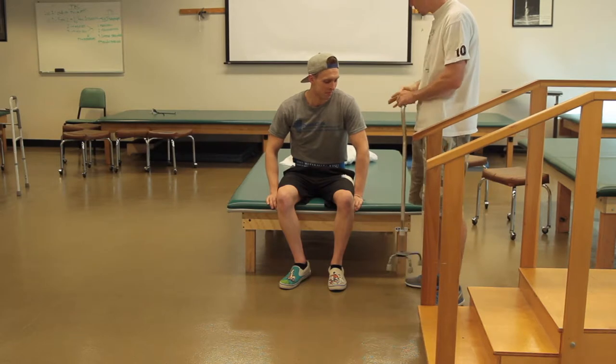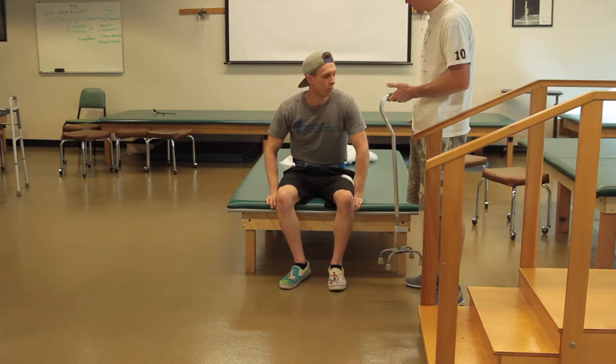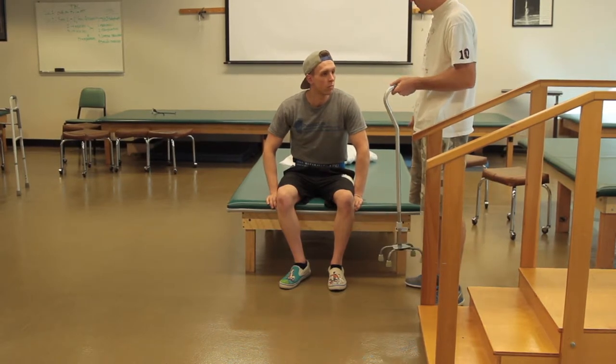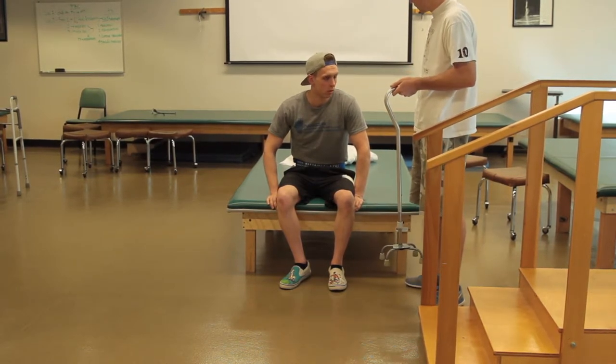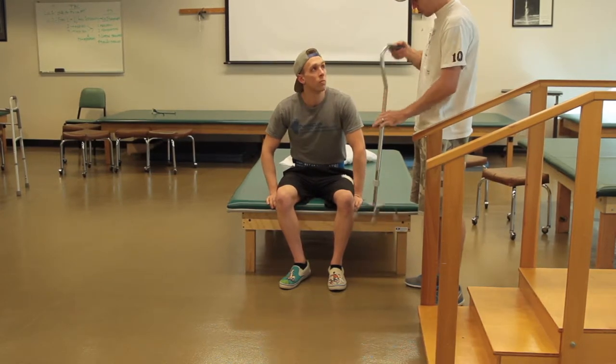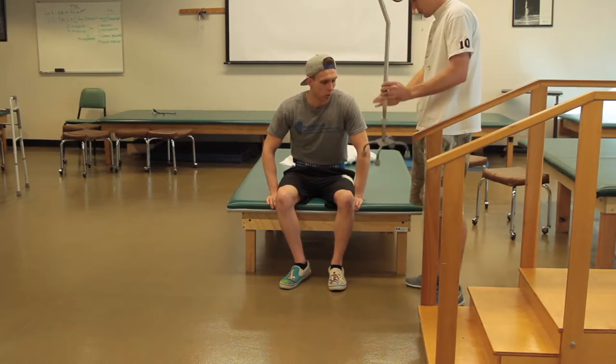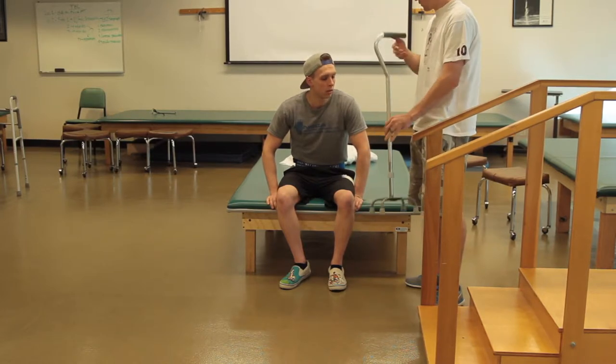Okay, so you've got the pain from your osteoarthritis in your right hip. So anytime you're going to use a cane, you want to use it on the opposite side of where you're having the pain. Okay. So in your case, it's going to be on the left side, and I've already got it situated so that it's set up to be used on the left side. Where you've got that flat side to post your feet.